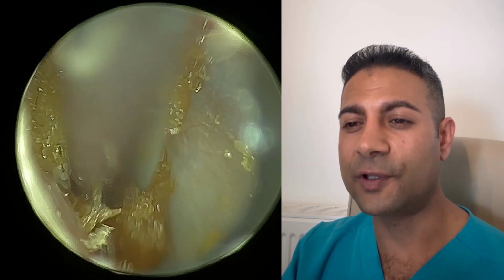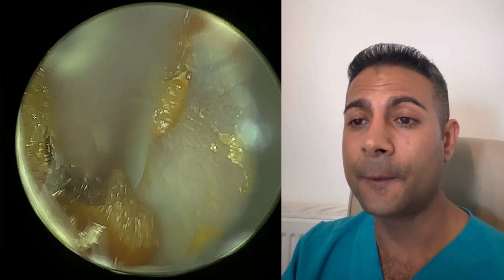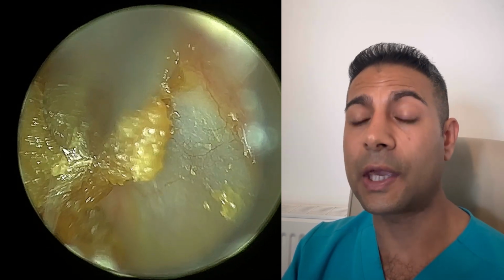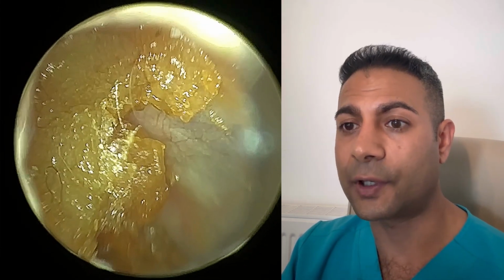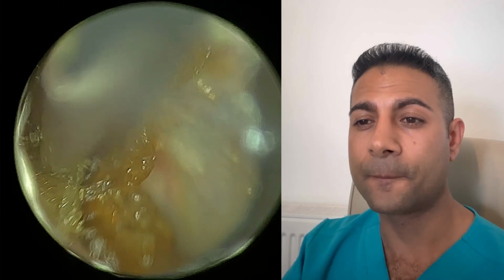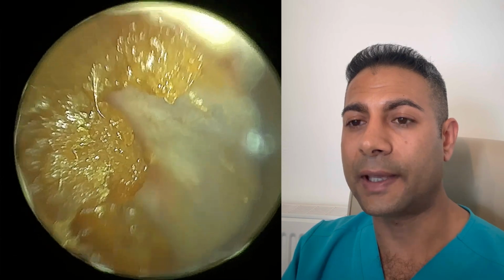As the procedure continues, you're going to see moments where I use the new Zoom feature, which is available via the WAXscope app. Now, the WAXscope app is at present only available in the UK and Europe, but it will hopefully be available worldwide. So you can use it with any endoscope or any otoscope that has a standard eyepiece. So I think the eyepiece is 37.5 millimeters, and it will connect.